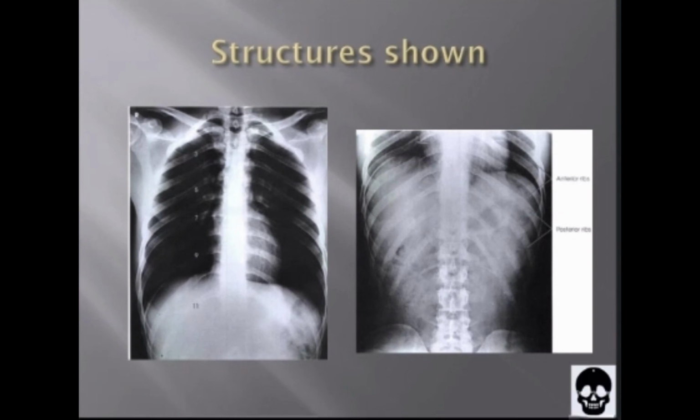The following should be clearly demonstrated. For ribs above the diaphragm, first through tenth posterior ribs from both sides in their entirety. For ribs below the diaphragm, eighth through twelfth posterior ribs on both sides in their entirety. Ribs visible through the lungs or abdomen. In a unilateral examination, ribs from the opposite side may not be entirely included.